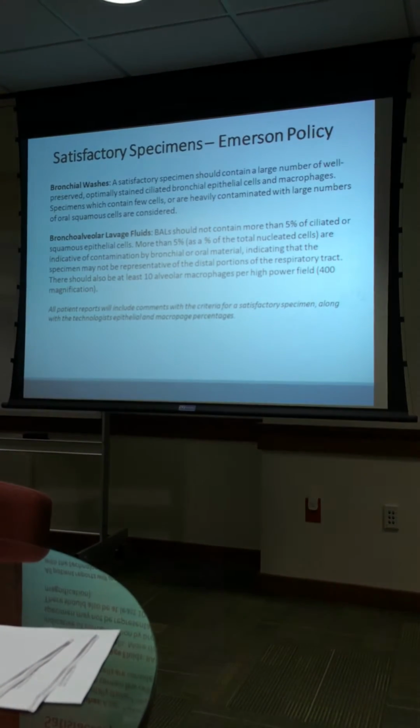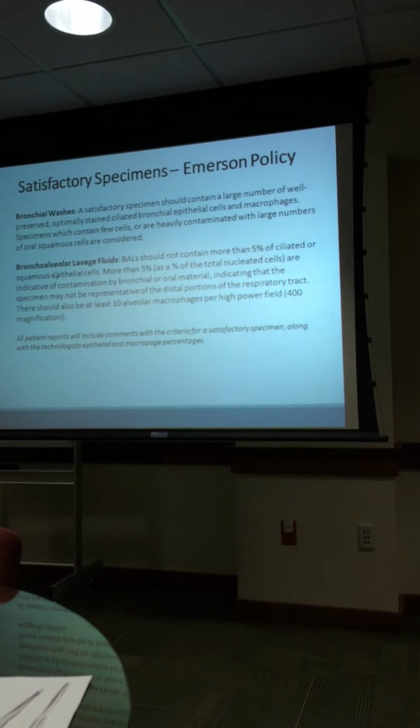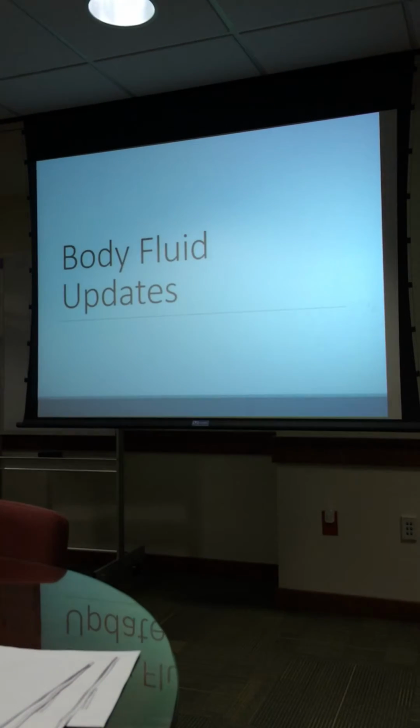Very few of the specimens that we're going to get are actually going to be called bronchoalveolar lavage specimens, right? Yeah, you said like 1 or 2 a year. Yeah. Most of what we get are washes.